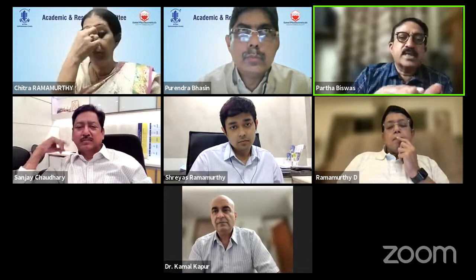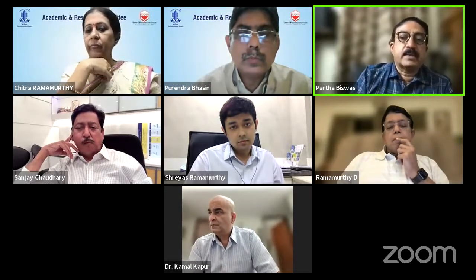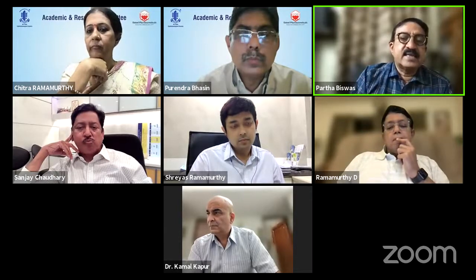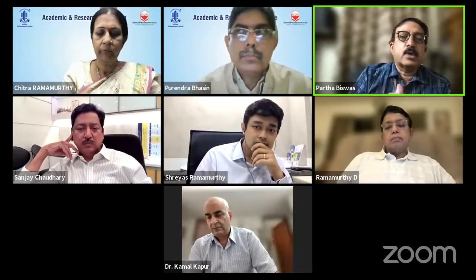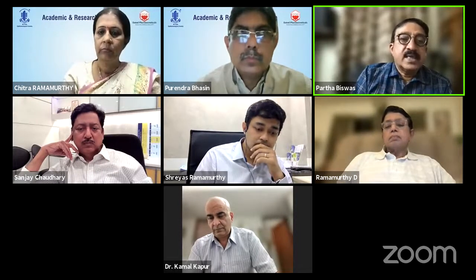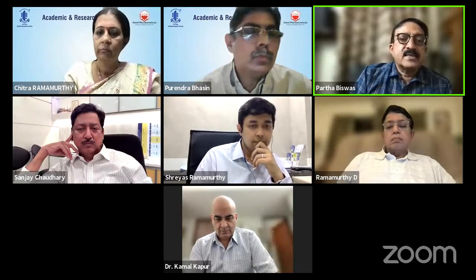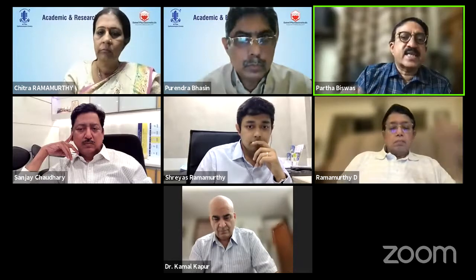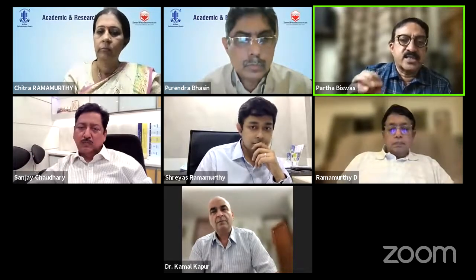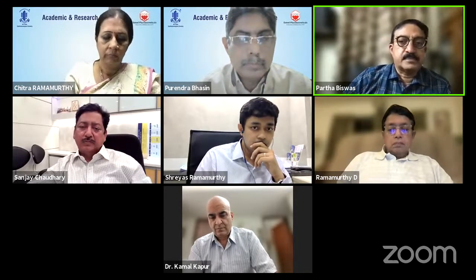Yeah. The other part of the question was 100 microns of vault. Now, these cases again have to be watched for cataractous change to take place. With these ICLs, I've been following up a couple of ICLs over quite some time, with about 100, 125 microns of vault. They have not yet developed cataract. This is nearly 2 years, 3 years now. There should not be a hurry to explant these lenses if it is carrying on. If the patient has not developed cataractous changes and the vision is fine, these patients can be carried on with close follow-up.